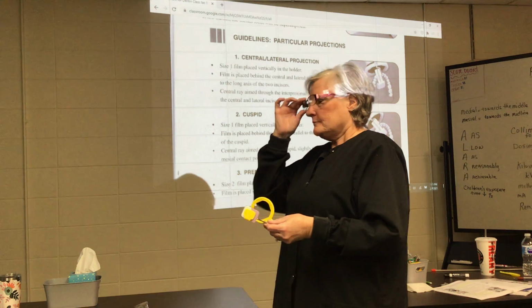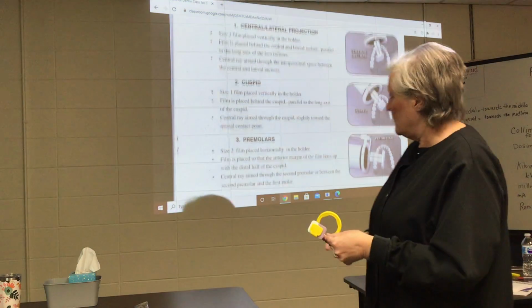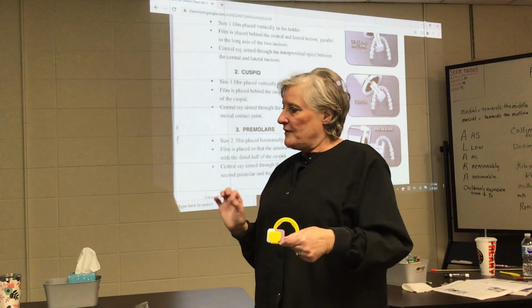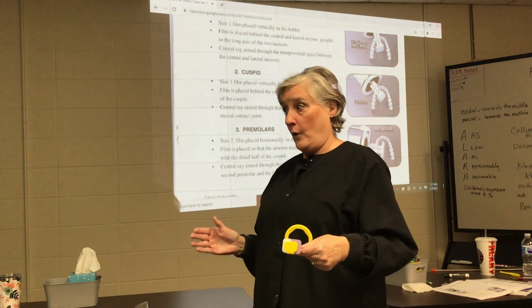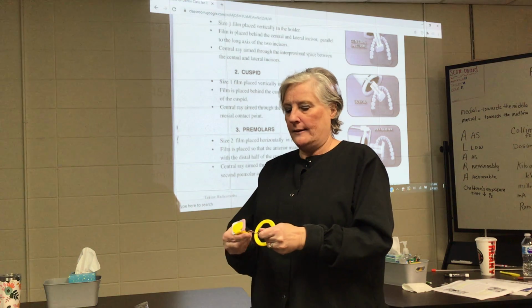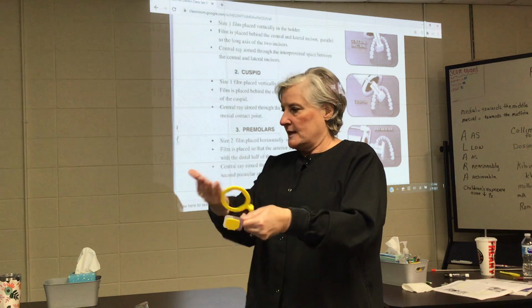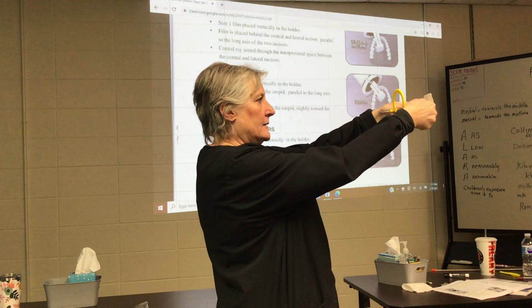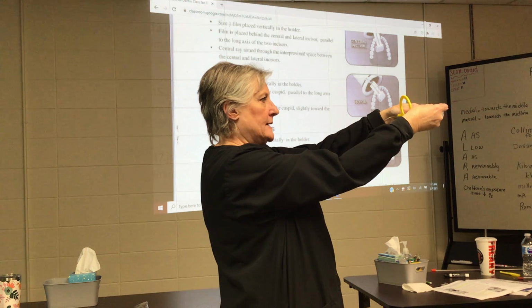To change it, you're gonna wanna do this one way every time. You're gonna do it the same way every time. So you develop your own sequence. This is mine, and it works well. And I can explain why here in a little bit. I'm gonna hold it in my hand so that the ring is closest to me. I can see everything. I'm going to take the bite block off and turn it over and put it back together.